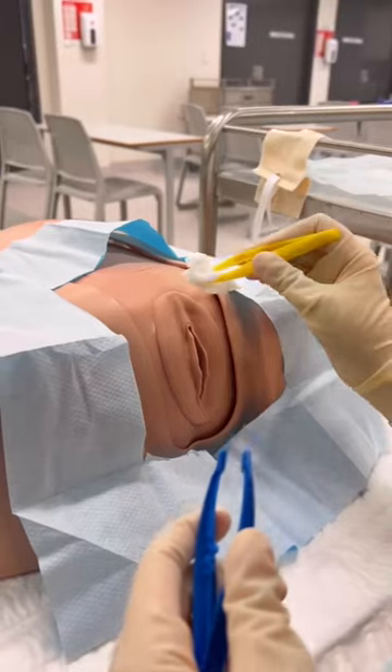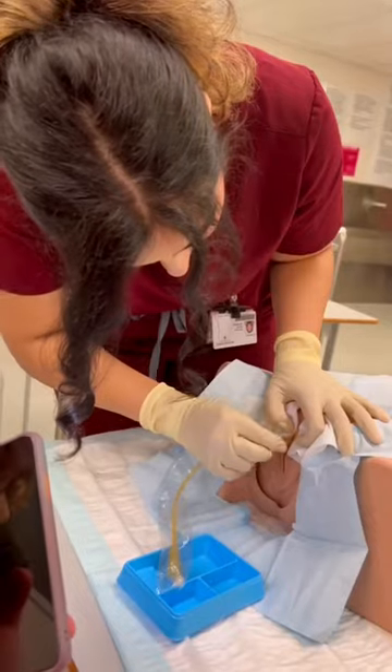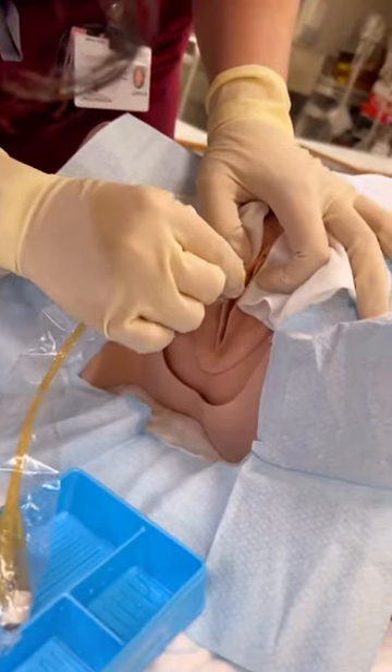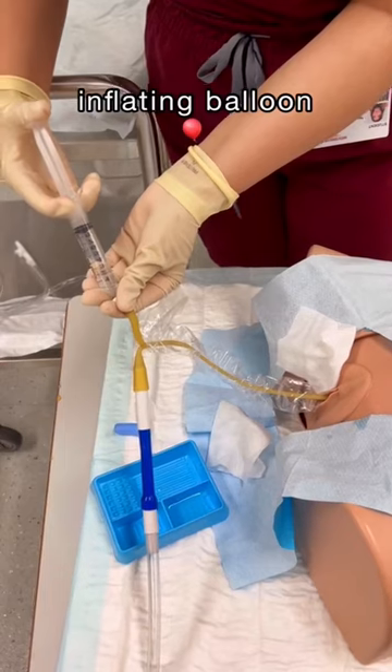I've established a sterile field and now I'm just cleaning off the patient, because obviously you don't want to give the patient an infection. Now I can actually insert the catheter, making sure I've got it in the right hole, and then inserting it until I know I'm in the bladder.